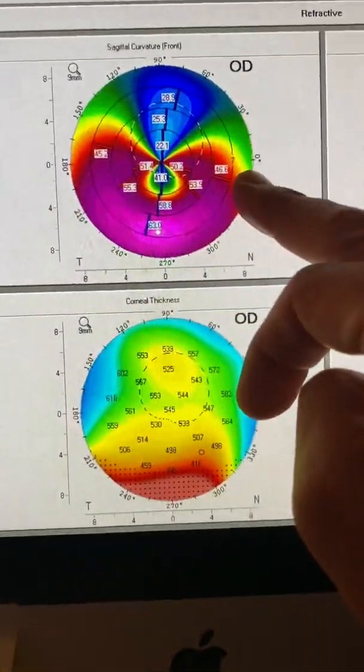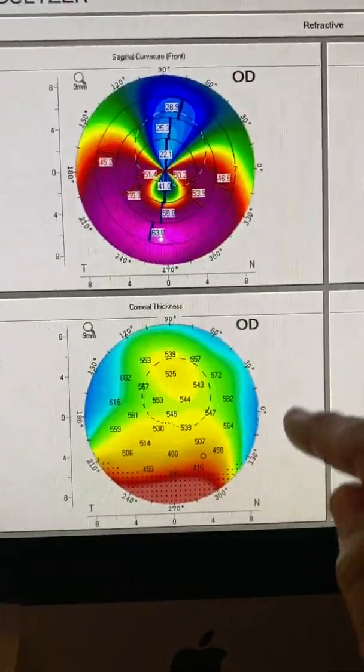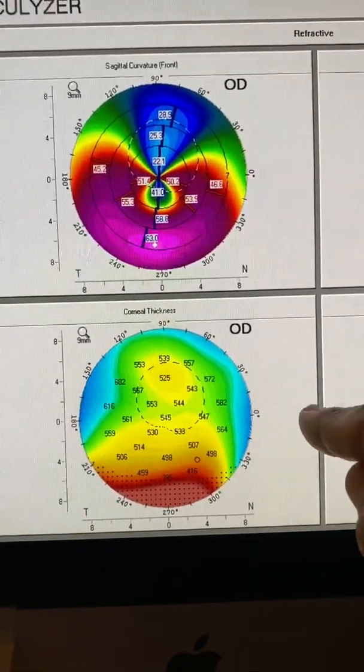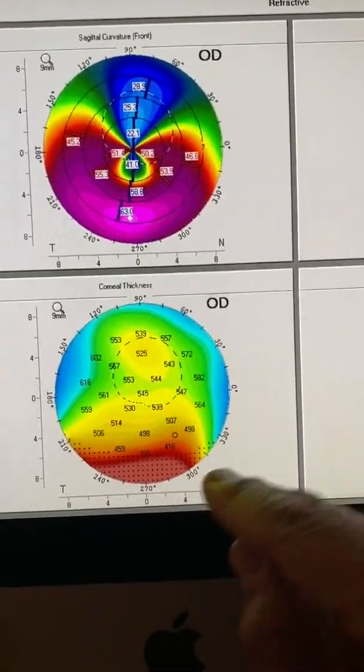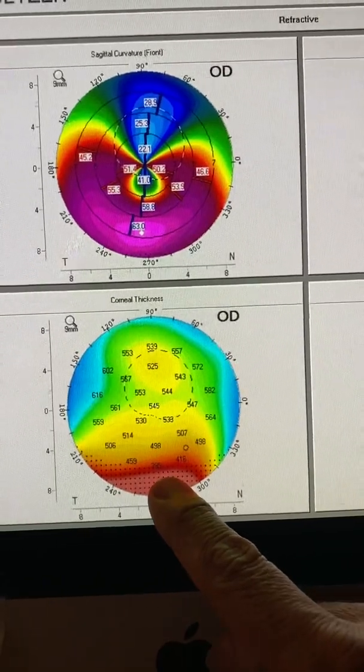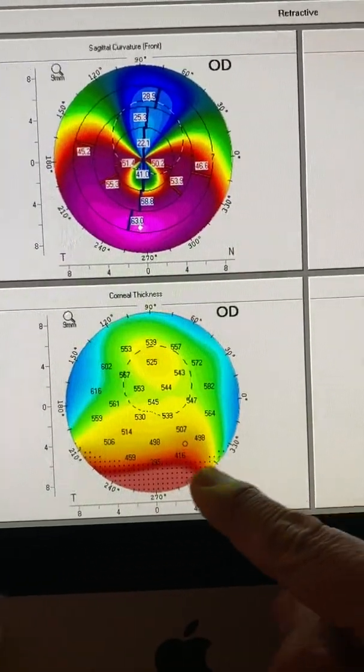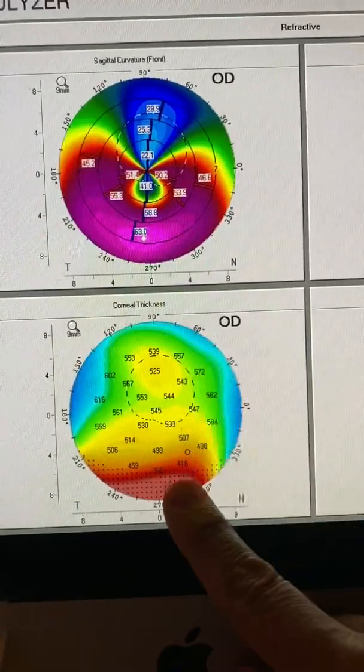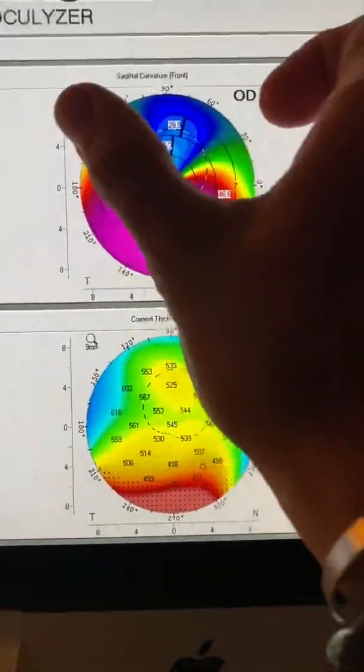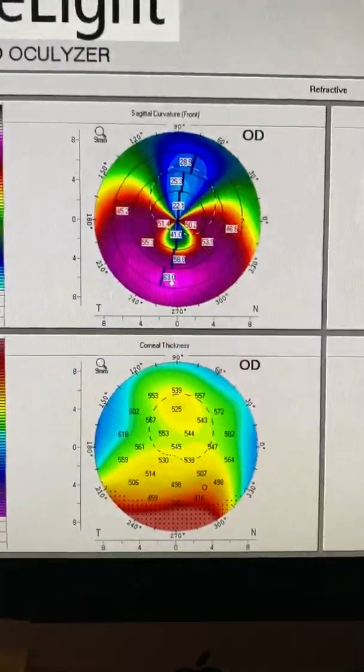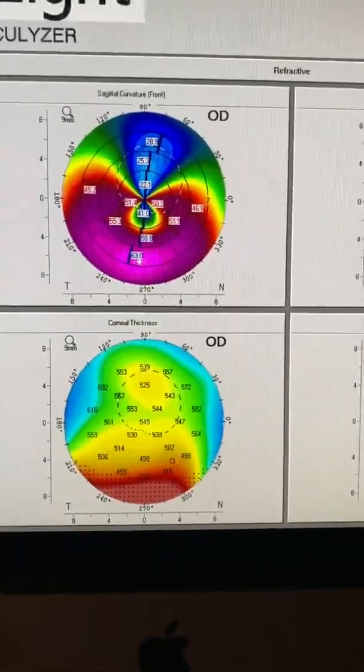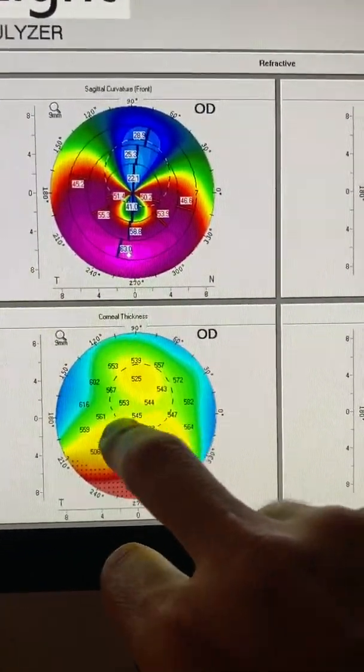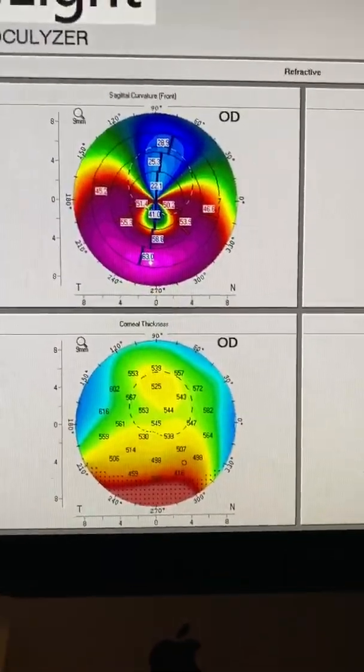You can see claw-like astigmatism here. And again, the sine qua non, in my opinion, that this is pellucid marginal degeneration, not keratoconus, is that the thinnest part of the cornea is this broad area near the inferior limbus. So this is pellucid and not a claw-like astigmatism on Pentacam that has a round, thin area somewhere off the center of the cornea.